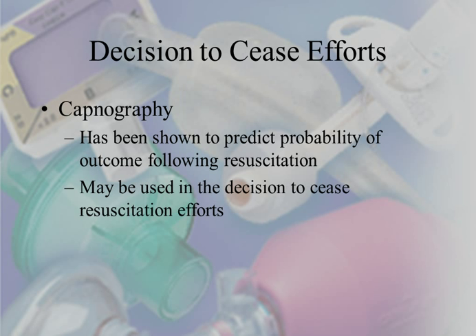All right, so the decision to cease efforts. It says capnography has been shown to predict the probability of outcome following resuscitation. It may be used in the decision to cease resuscitation efforts.